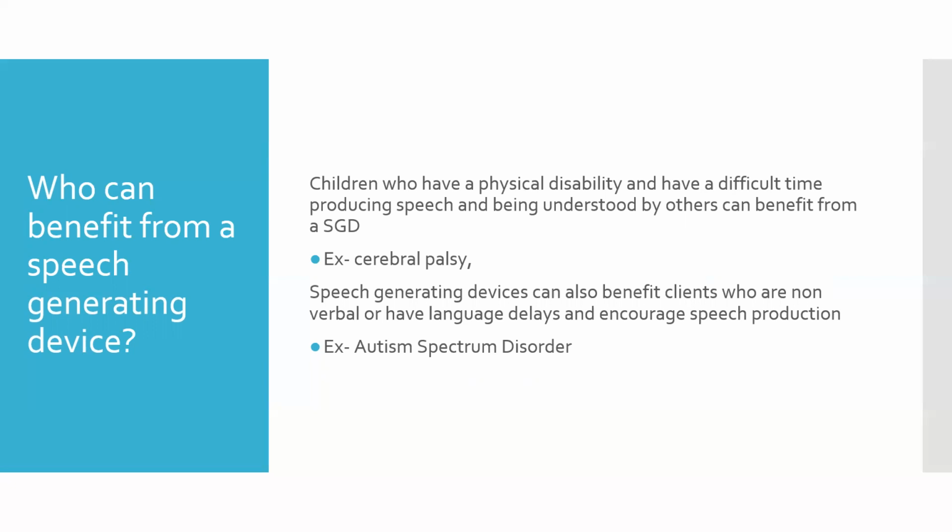However, speech-generating devices aren't only for people with physical disabilities. They can also benefit clients who are, for example, nonverbal or who have language delays. Studies have shown that speech-generating devices can actually encourage natural speech production. For example, there are a number of studies coming out on how speech-generating devices can benefit people with autism spectrum disorder and support language skills.